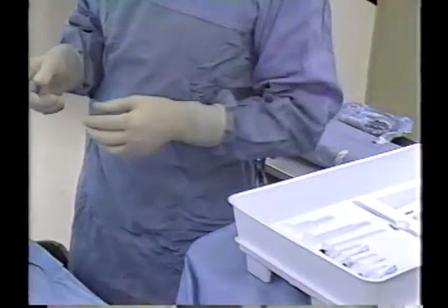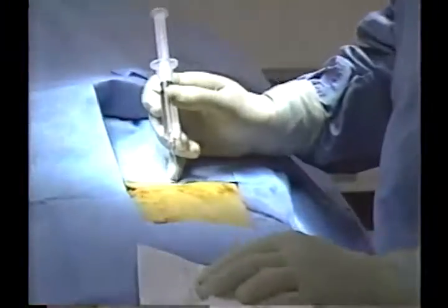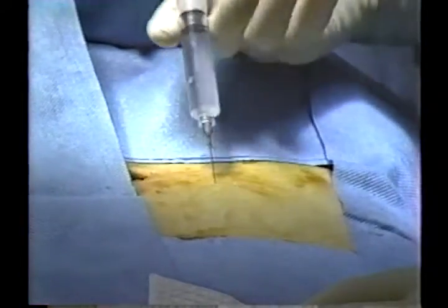Before the skin incision is made, a longer needle is selected and used to anesthetize the deep tissue down to the peritoneal cavity.